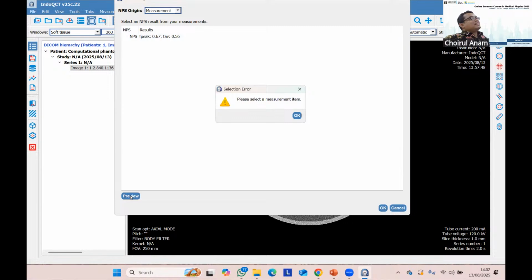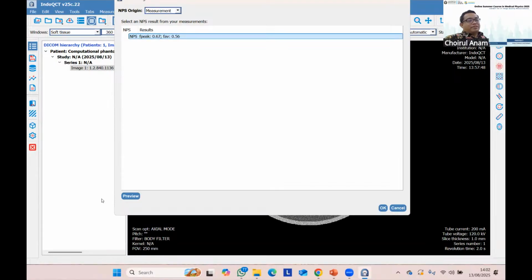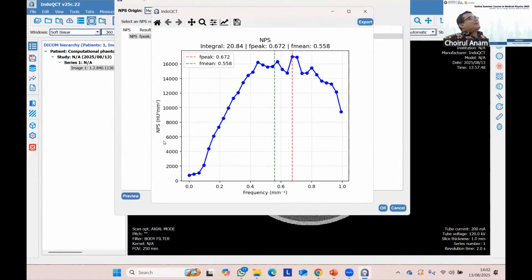We click this one first, and then preview. Yeah, this is the NPS from the measurement.